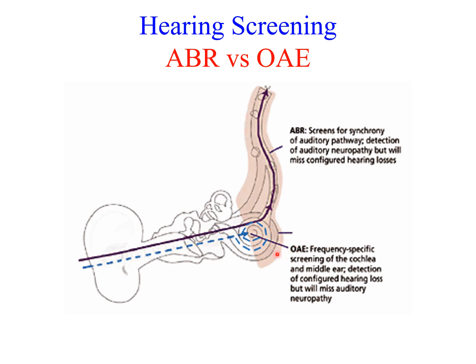So the ABR and OAE for hearing screening, they have pros and cons for each. So at the end, it really is up to you on which method you want to use for hearing screening in your clinic.